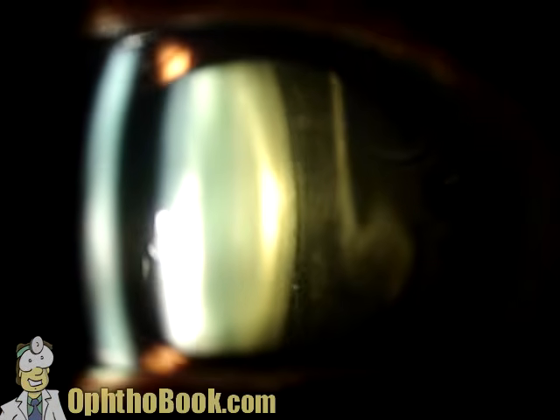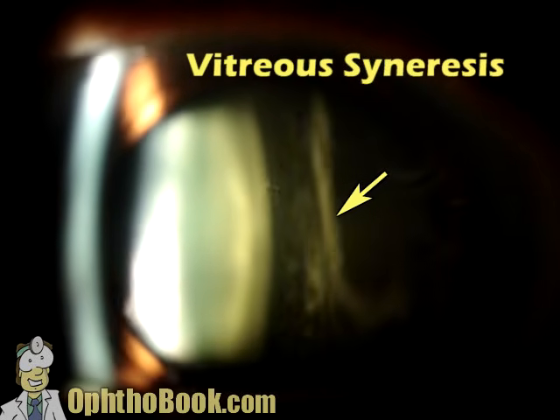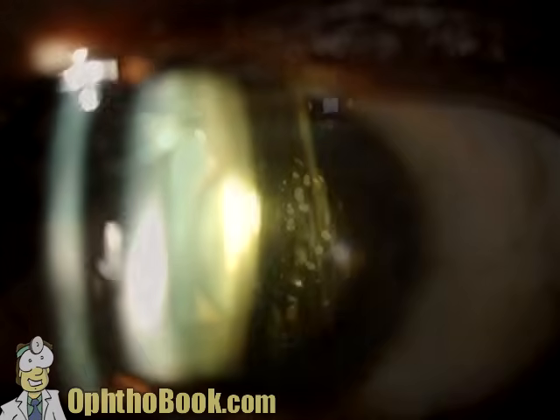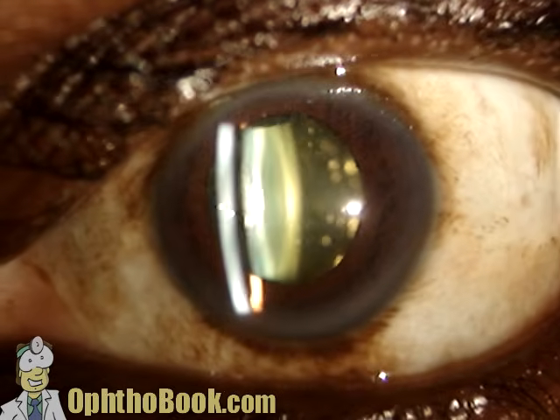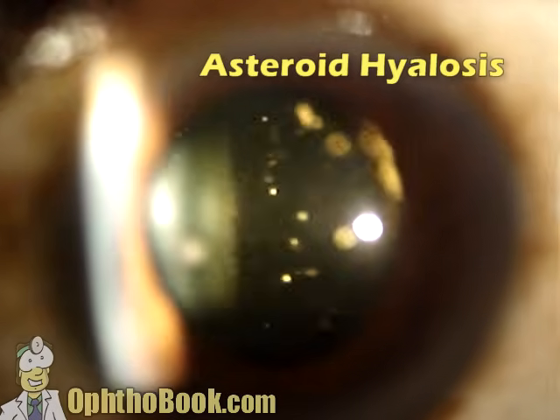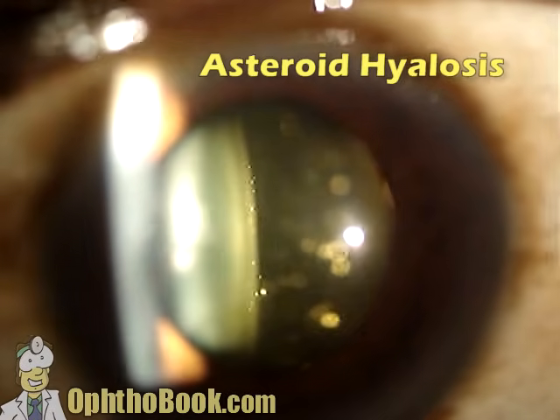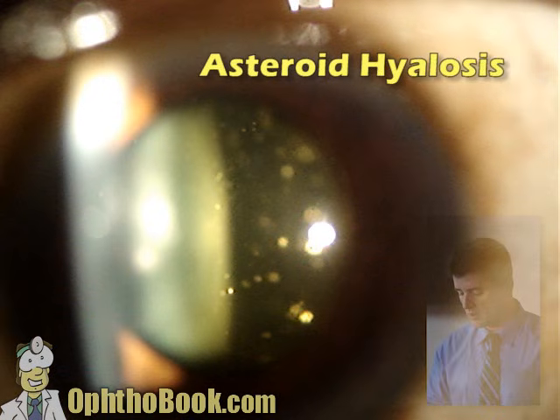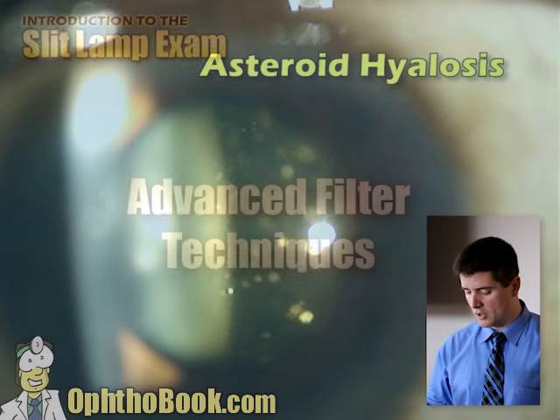But normally when you look back there, what you'll see is something more like this. This is a vitreous detachment. You can see just sort of a sheet back there like a curtain, and that's just that vitreous jello contracting. And finally, this is a case of asteroid hyalosis, which is a calcium soap deposit that forms in the vitreous body, forms these little floating stars in there. They look impressive, but they don't cause a whole lot of visual problems for the most part, and they don't really indicate any real eye pathology.